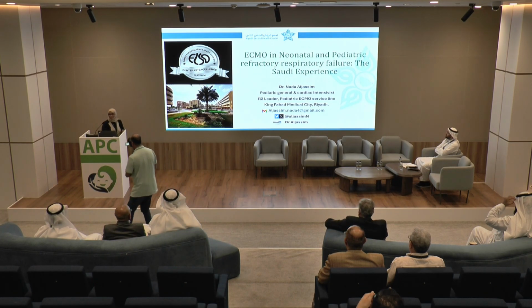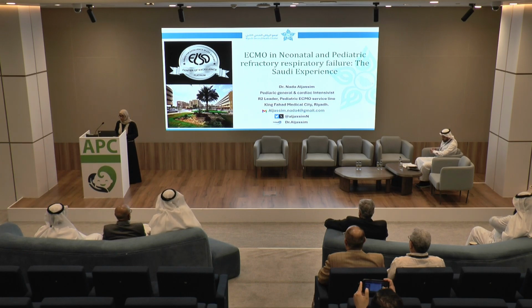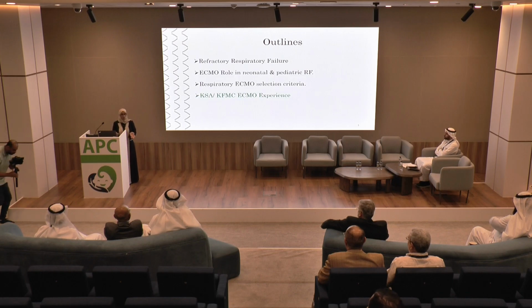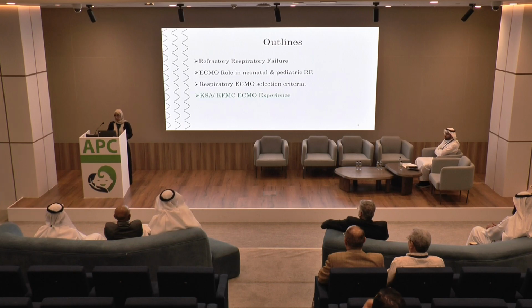Okay, perfect. So we're talking today about one of the advanced technologies that we use in refractory respiratory failure, with the Saudi experience, and I have nothing to disclose. So what is refractory respiratory failure and what is the ECMO role? For those who don't know what ECMO is, I don't need to spend time on it. It is an artificial lung for refractory respiratory failure, basically an extracorporeal membrane oxygenator that acts like an artificial lung membrane.